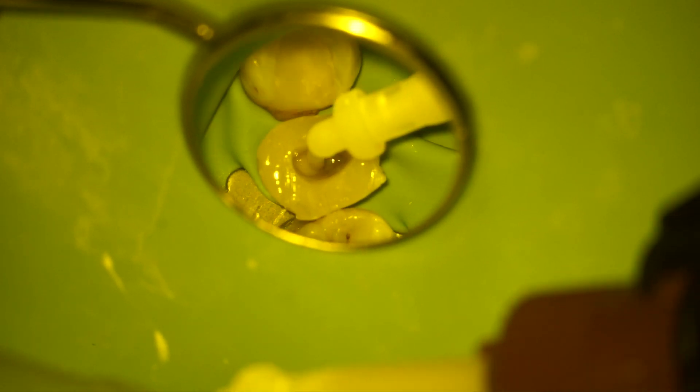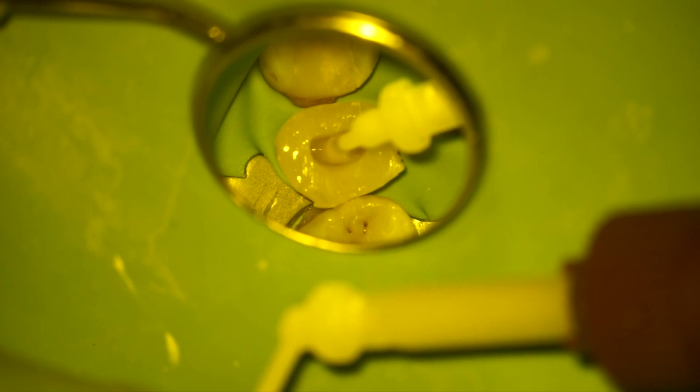In this case I used my DC core build-up material directly in the canal. As you can see, because I have a wide canal, I applied two glass fiber posts.